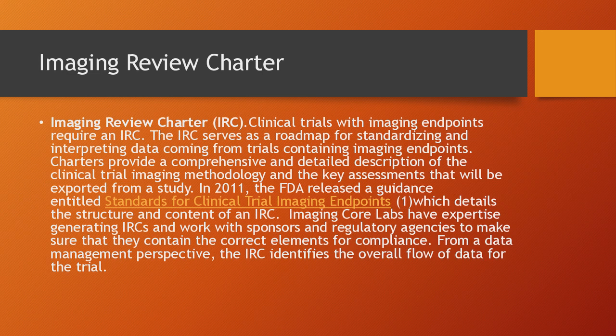But what FDA is telling us is that we have to incorporate within our companies an imaging review charter, let's say a document or protocol describing how the images are received in our virtual core laboratory, how the images are managed, what are the quality parameters, how we perform the quality check reports, how the images are analyzed, using which techniques, how the images are read by radiologists or nuclear medicine specialists.